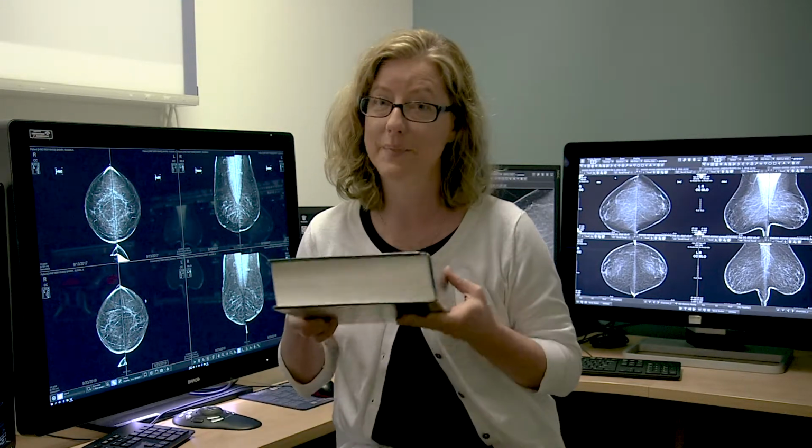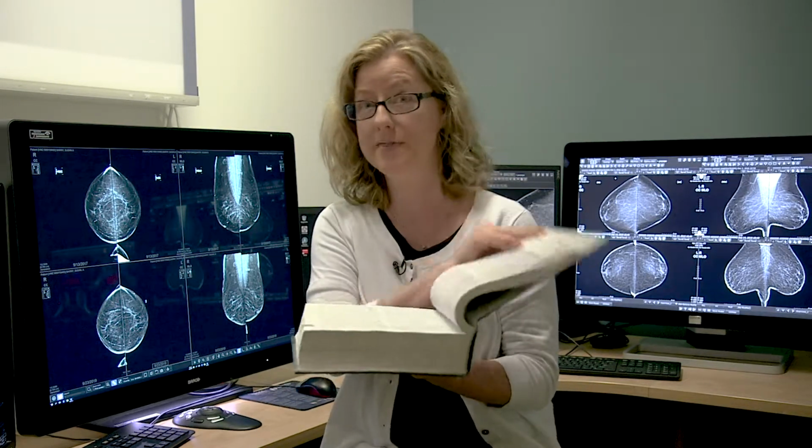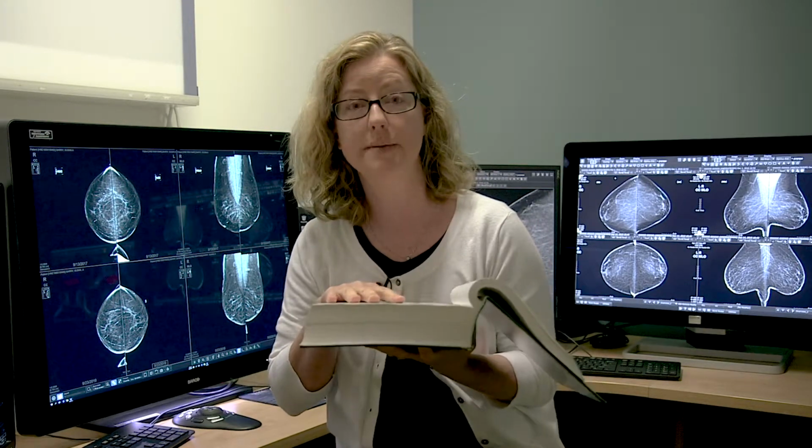But what happens is when the 3D machine takes the pictures, it moves in an arc over the breast, and in just under 4 seconds it takes 15 low-dose pictures of the breast from the top and then from the side. The machine is then able to reconstruct those pictures into multiple stacked 1 millimeter layers of the breast, like pages of a book. So with a 3D mammogram, it's as if we can open the book and look through page by page, instead of taking one picture from the top or from the side.